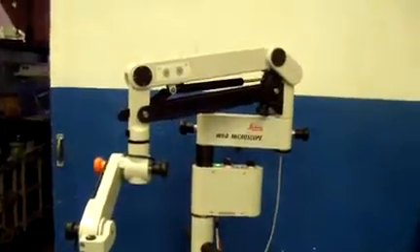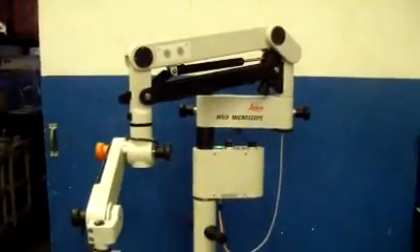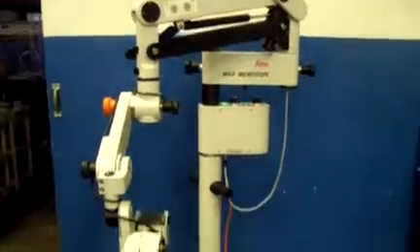Hey, it's DCSP Medical. We're looking at a Leica M651 microscope. It's in excellent cosmetic condition. All the areas of articulation seem to be working, the lamp powering on.